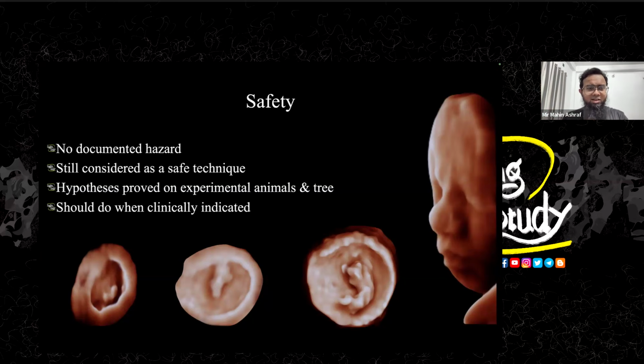If you think ultrasound can cause adverse effects, remember that even X-ray is now considered safe in pregnancy. But it doesn't mean that we are using X-ray all the time. We use X-ray whenever it is necessary. So we'll do ultrasound whenever it is necessary.